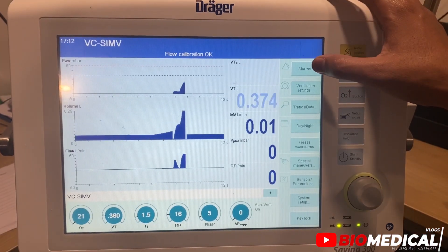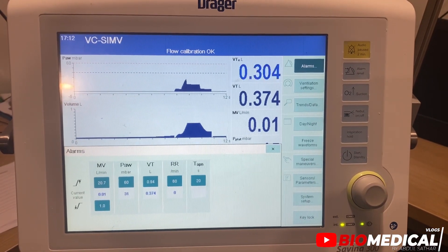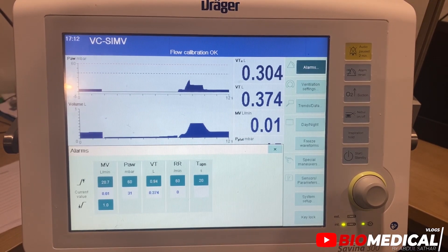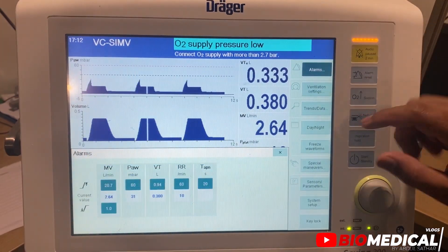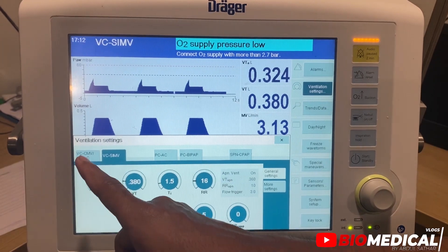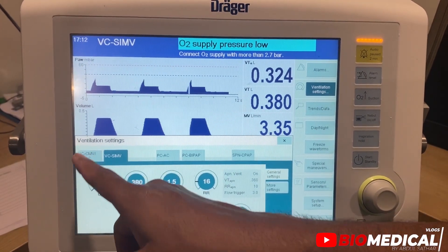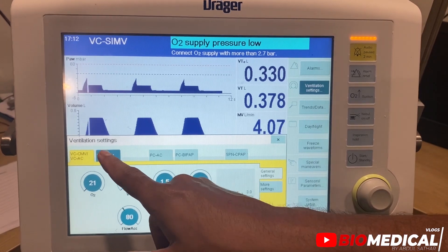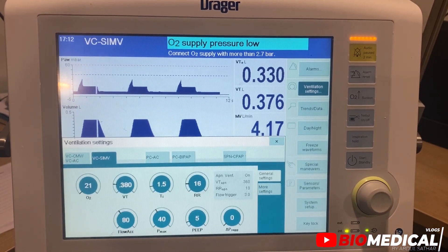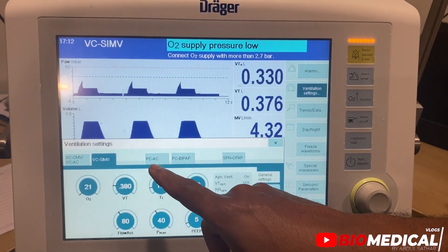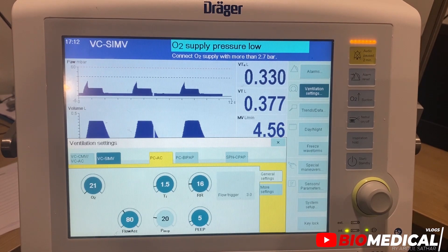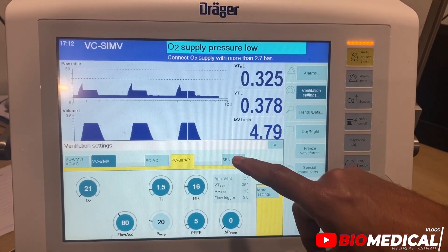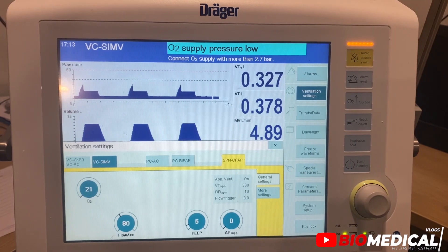Now we can check the different options available on the display. We can set the alarm limits here. Then we have ventilator settings — we can see the different ventilator modes. Depending on the ventilator mode, we need to set the FiO2 percentage, tidal volume, inspiratory time, respiratory rate, flow acceleration, Pmax, and PEEP.